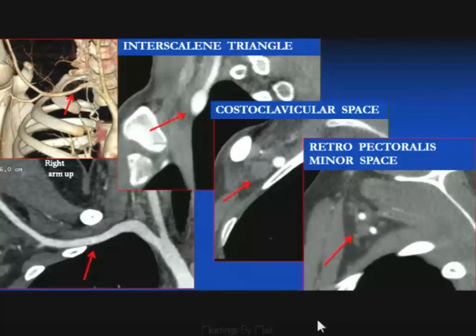So these CT angiographic studies are used in patients who have, quote, repetitive stress issues. Either a thoracic surgeon or vascular surgeon is using this angiographic study as a surrogate for looking for brachial plexus compression, because brachial plexus compression can occur in this space or this space, and if you demonstrate significant compression of the artery, then that's a surrogate for saying, well, maybe this brachial plexus needs to be relieved of that pressure, and that may lead to a segmental resection of the mid-first rib.